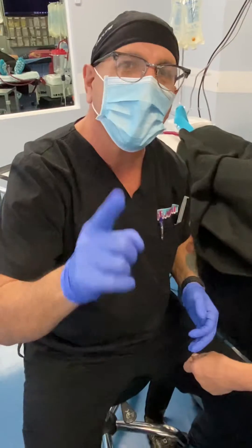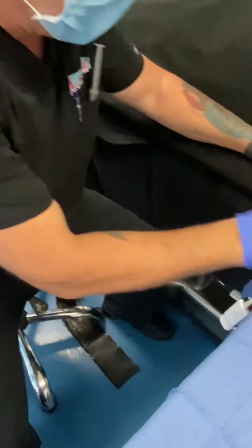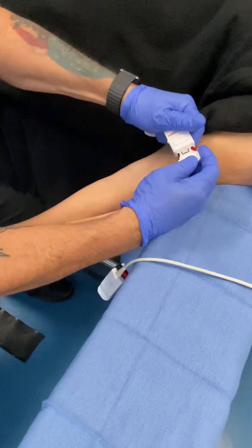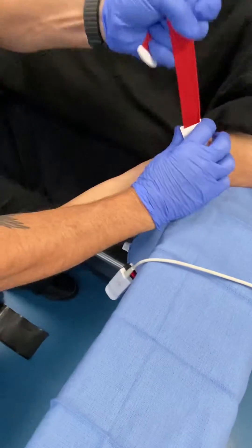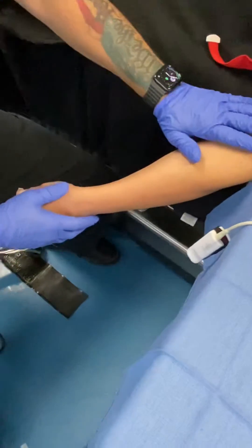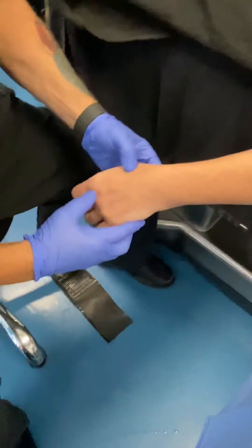We're going to put this on reels for the first time, so let's see how it works out. The patient's arm is kind of hanging in a dependent position. I get my high-tech tourniquet here, fire that bad boy up. That really hurts, and I tell the patient that it's going to be a little uncomfortable.